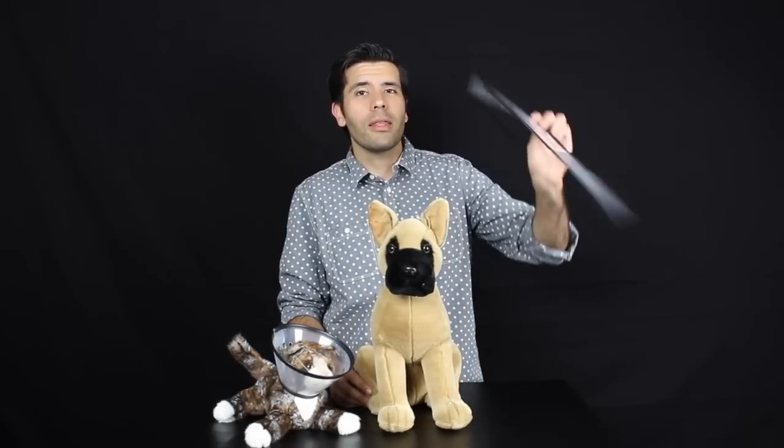Hi everyone, Don Cheadle here for the Vet1 line of collars. I want to talk to you about the safety collar.